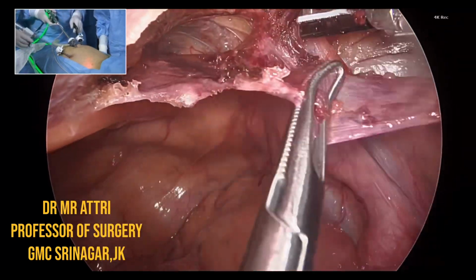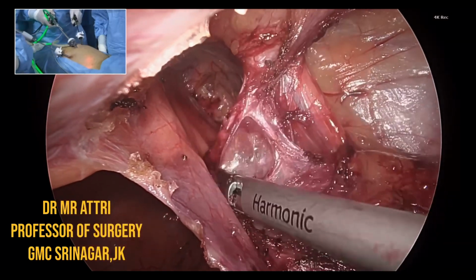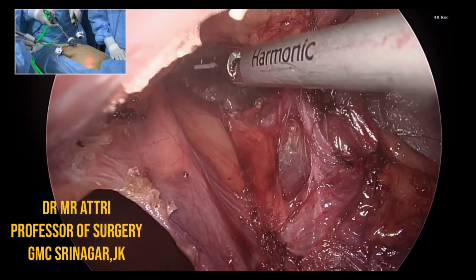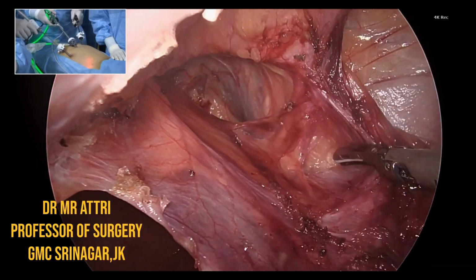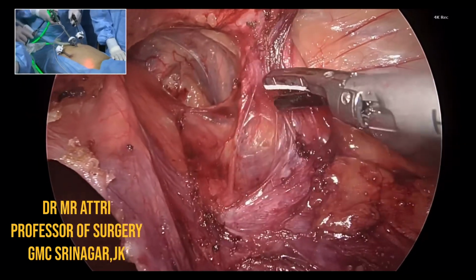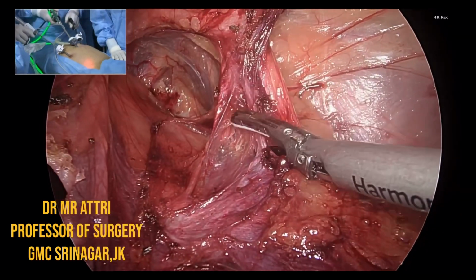Now this counts as an L2 and W1 hernia, because on CT the defect size is 4 cm by almost 3.5 cm. You can see how much the defect actually is. Now, what are the challenges with this hernia? The first challenge is that this is a small abdomen, so there is limited working space. Second, it's a lateral hernia, a boundary wall hernia.